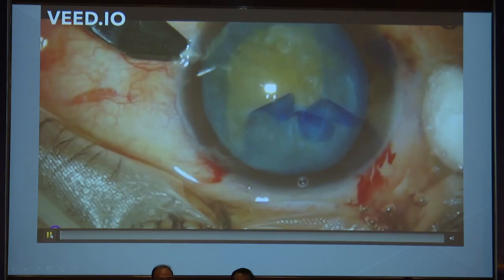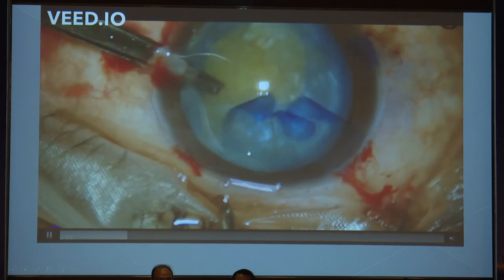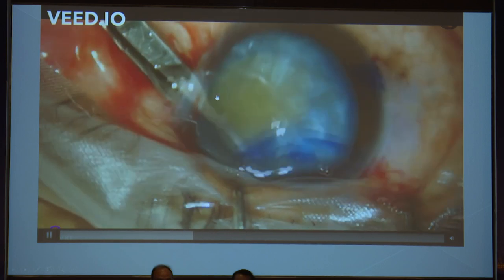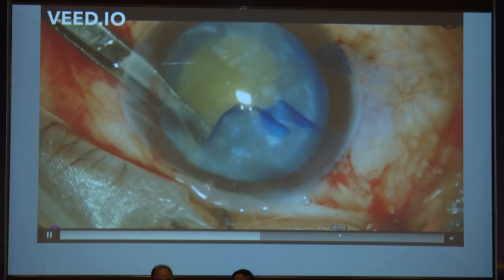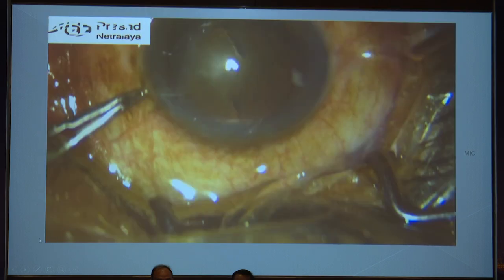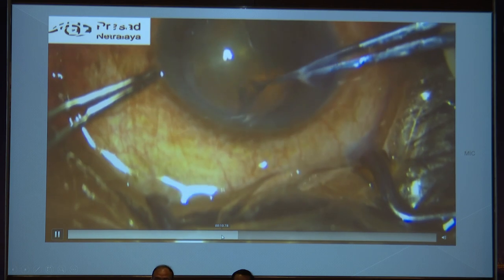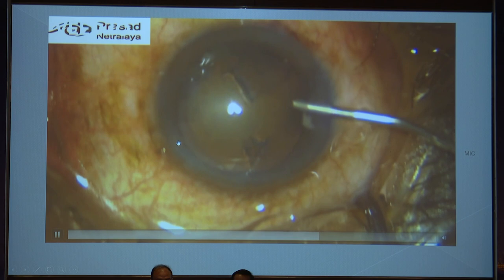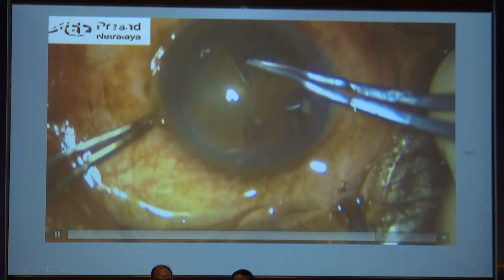If it is not sub-incisional, then access to that area might be difficult. This is an old video wherein a keratome was used to enter so that the Vannas had access to that area, and then you go on to continue it. Of course, now we have our micro scissors and micro forceps. Whenever there's a run out, we can always make a small side port through which our micro instruments can come in. And did I forward it too fast?